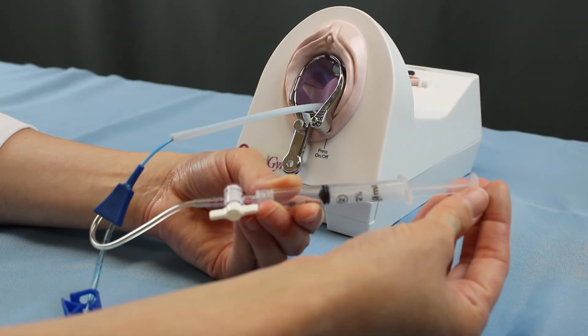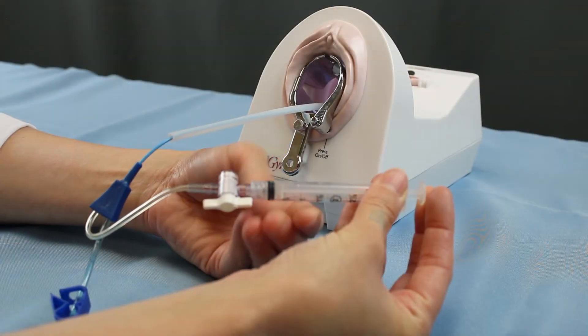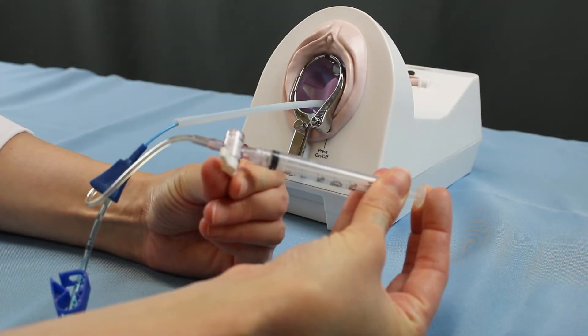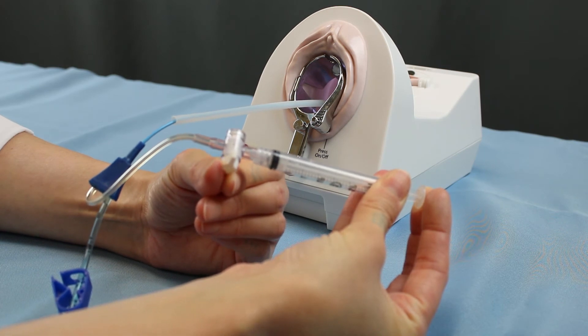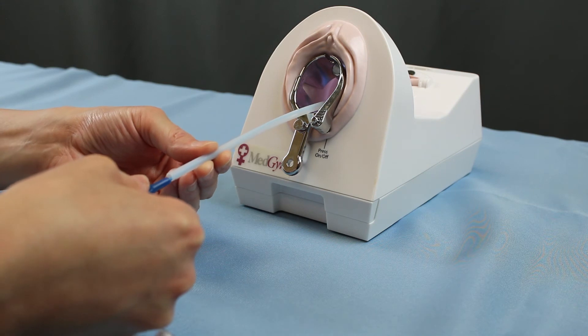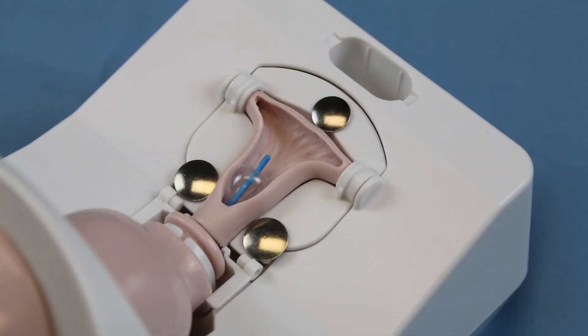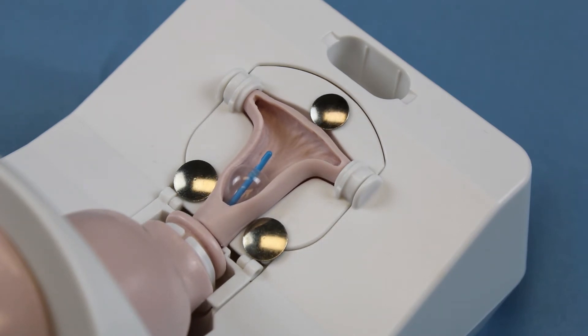Gently inflate the balloon to the preset volume and close the stopcock by rotating the white knob 90 degrees in either direction. Next, dock the placement sheath and carefully pull back the catheter to create a seal between the uterine cavity and the endocervix.